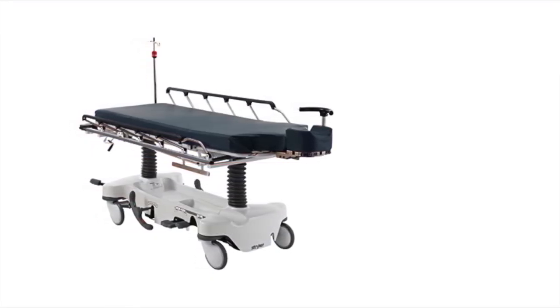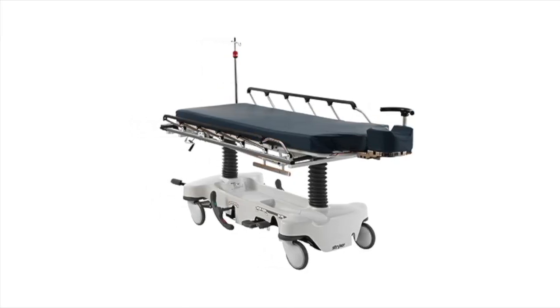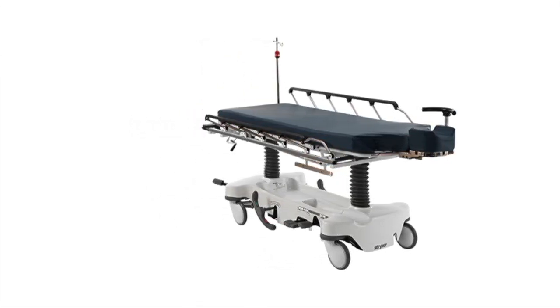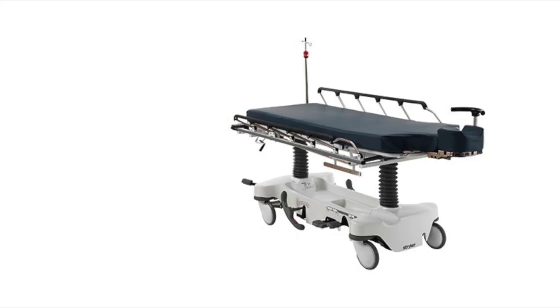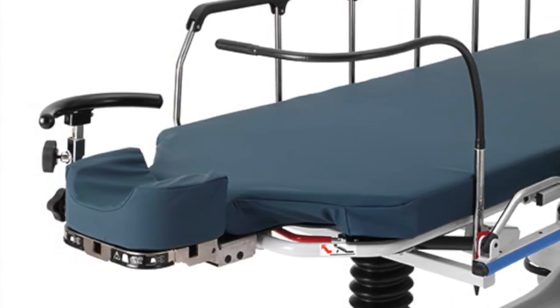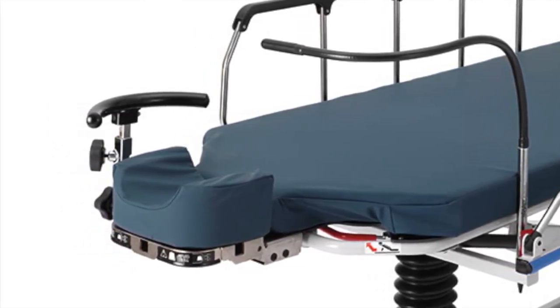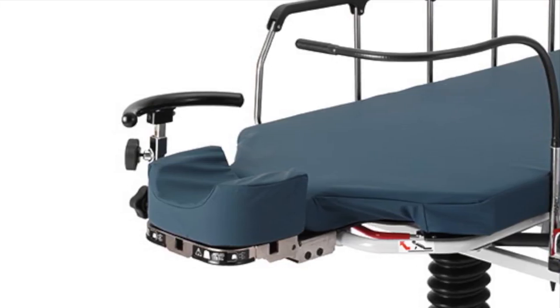The Stryker 1079 Eye Stretcher is a general purpose patient transport and treatment stretcher. It offers head end clearance for surgeon access with positioning controls tucked within the headpiece, allowing full articulation. The reliable work surface and mobile design increase patient security.